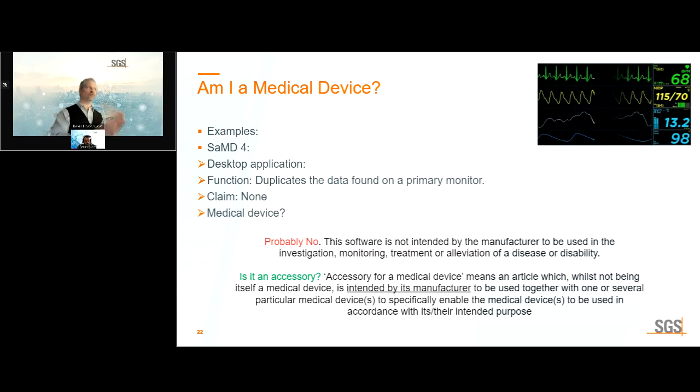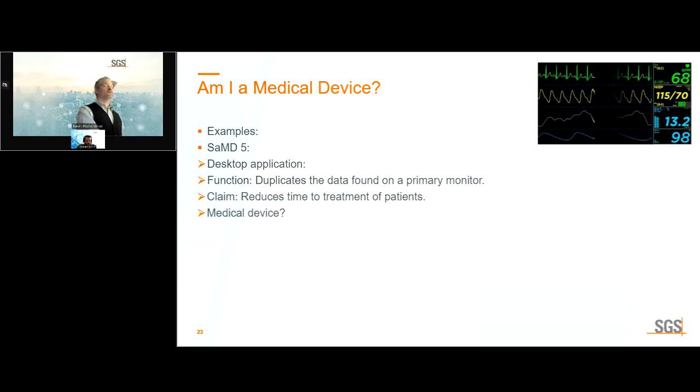So this starts getting really right on the edge of, it depends on how you phrase it, how you market it. So let's make it a little bit more. Same exact device. Nothing's changed about its actual software. Not a line of code is different. But now the marketing team has made the claim it reduces the time to treatment for patients. Exact same device, new claim. Is this a medical device?